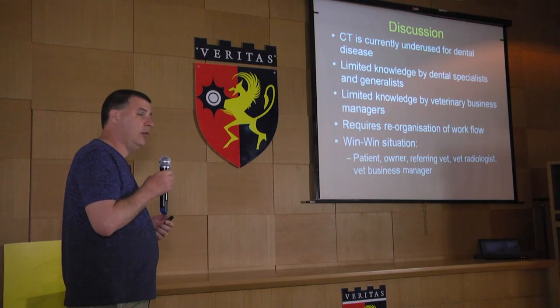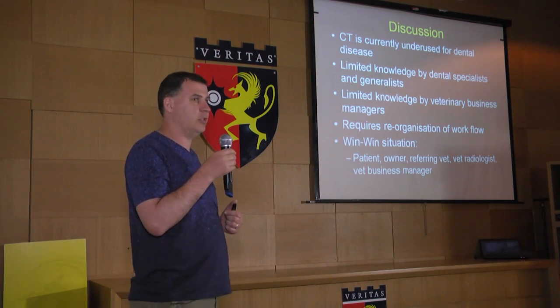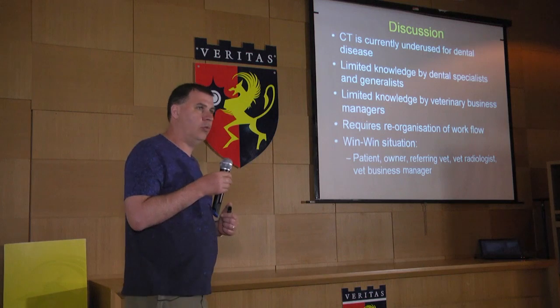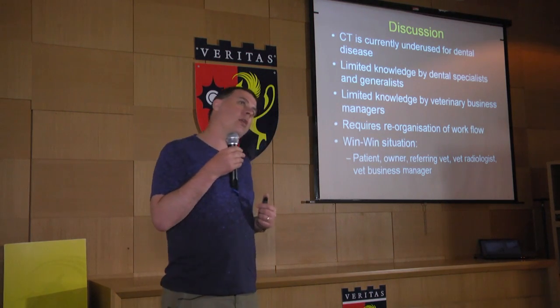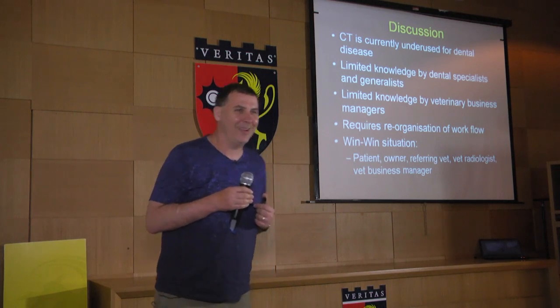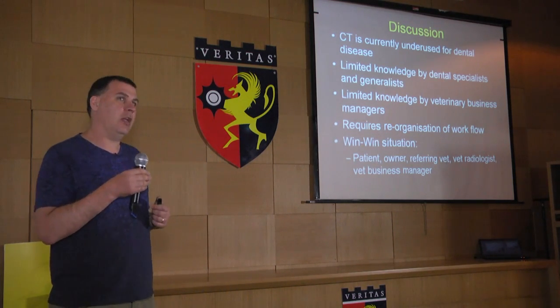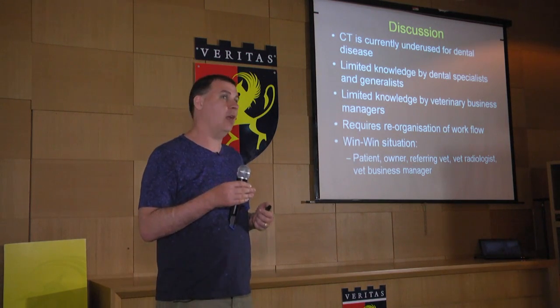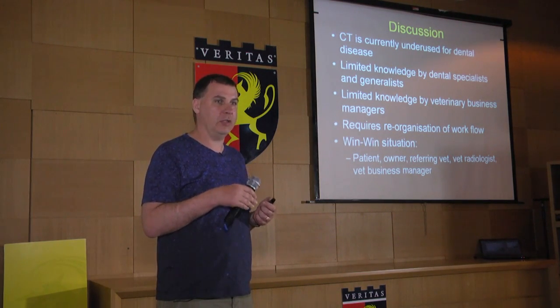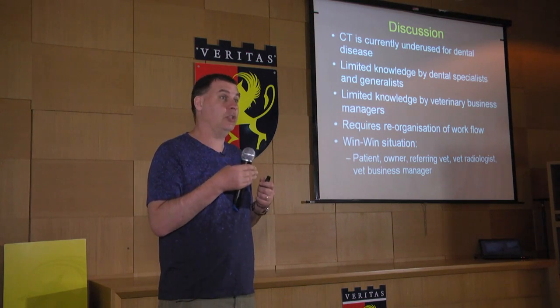And that's why I think CT is underused for dental disease. One of the reasons is that the people who do specialize in dental disease don't know much about CT, and so they don't ask for it. And also, people who run a clinic, a business, need to run CTs and other imaging modalities in an economical way, and they don't understand yet the frequency of dental disease and how useful CT is. Because basically, a dog comes in with some problem of his head, you do a CT scan, and a third of them will have some dental disease that also can be treated. So that is revenue for the practice. It is a good thing to do for the patient. And because owners are understanding about dental disease, they are likely to be willing to have that treated.